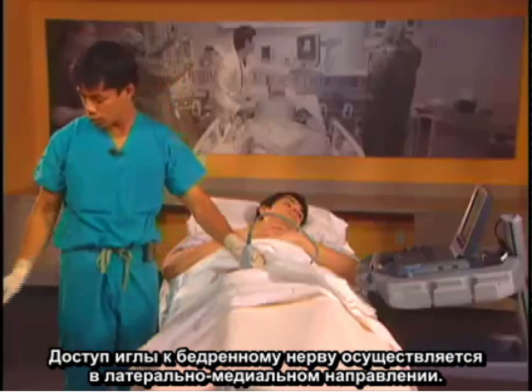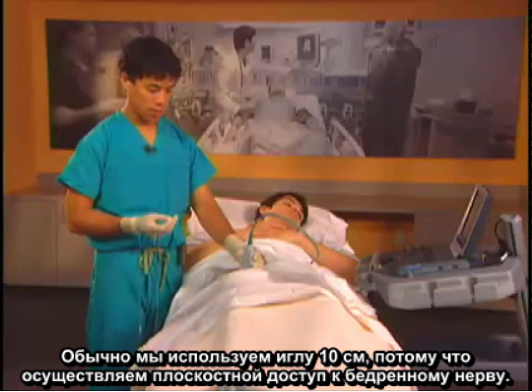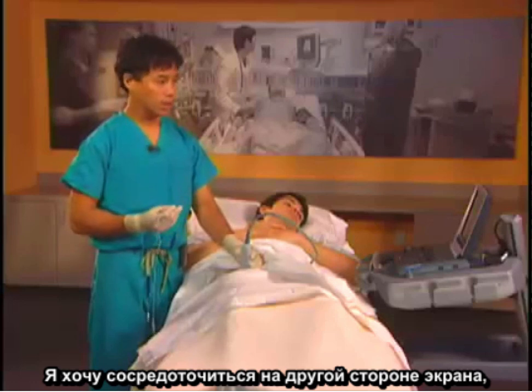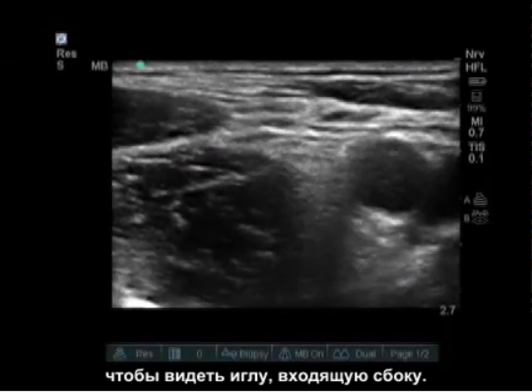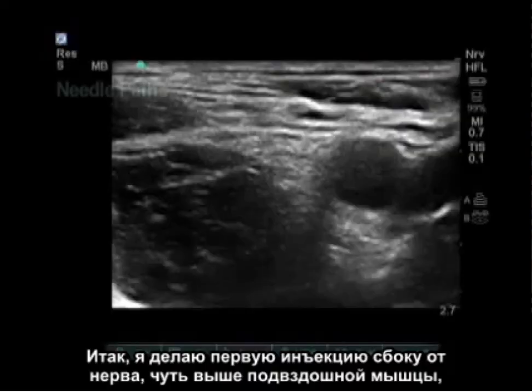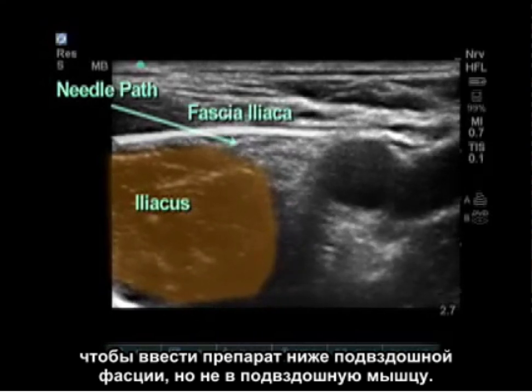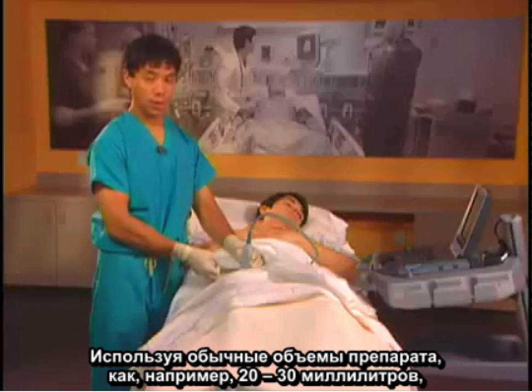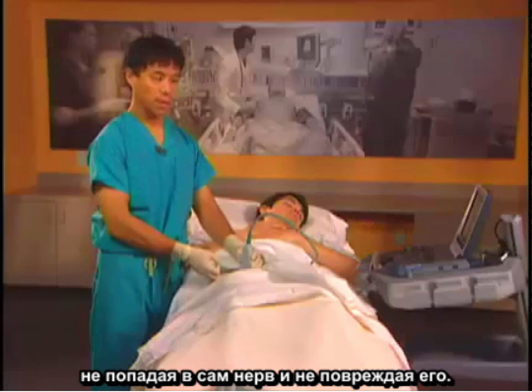Our needle approach to the femoral nerve is going to be from lateral to medial. Typically, we use a 10 centimeter needle because we use an in-plane approach to the femoral nerve. I like to put my target on the further side of the screen so I can see my needle coming in from the lateral side. I'll put my first injection lateral to the nerve just above the iliacus muscle to ensure injection below the fascia iliaca but not within the iliacus muscle. By using typical volumes such as 20 to 30 milliliters, we'll get spread above or below the nerve without poking into and damaging the nerve.